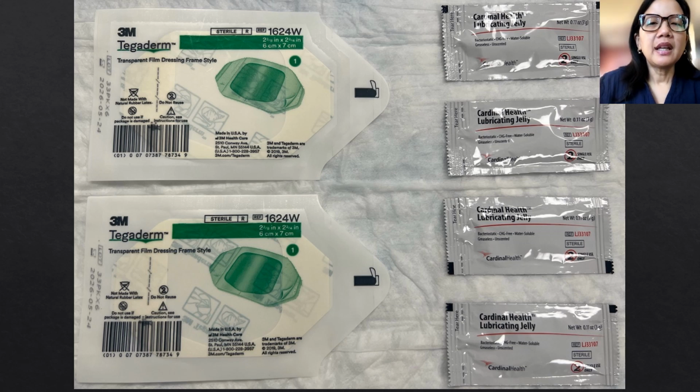These are the supplies that you should gather for your exam. This includes Tegaderm as well as packets of sterile surgical gel. I tend to like to use the sterile surgical gel packets instead of the big bottle of ultrasound gel, just because of the concern that some of the gel is going to get into contact with the mucosal surfaces of the eye.